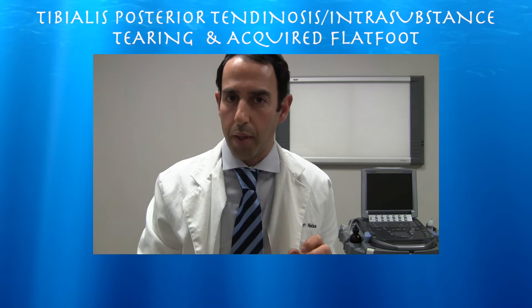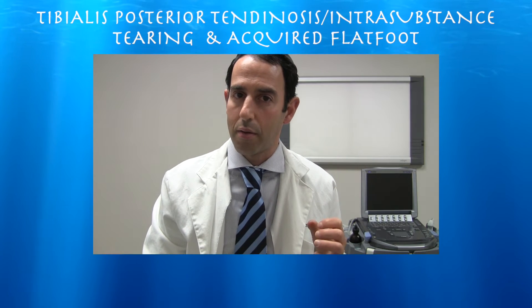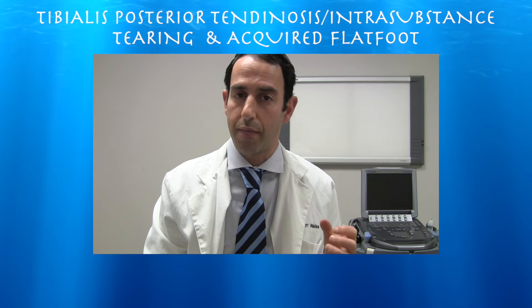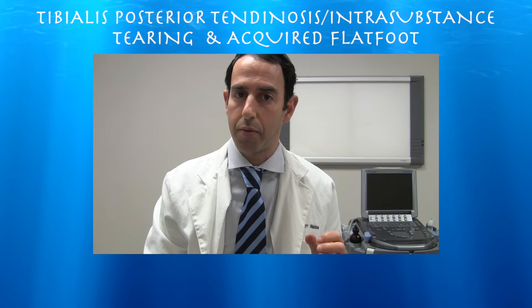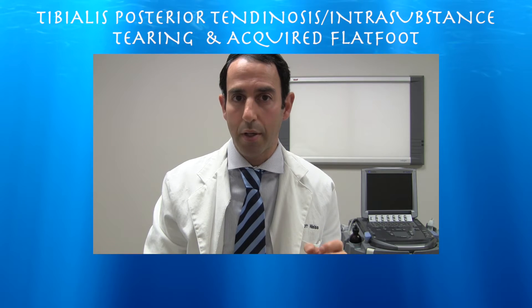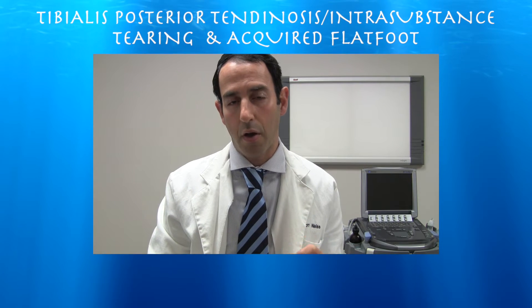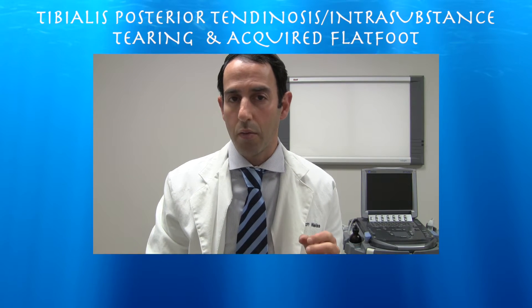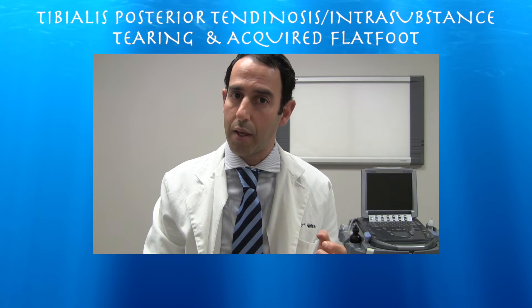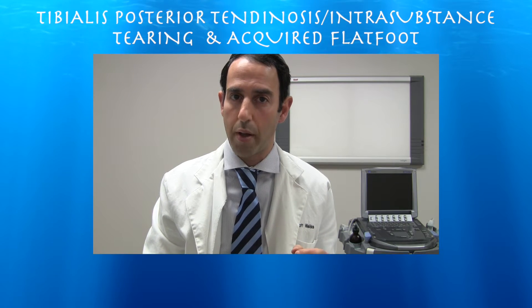This is a 48-year-old male with a flat foot deformity of the left foot caused by dysfunction of the tibialis posterior tendon. He did present with an MRI, and I subsequently did an ultrasound to compare my findings on ultrasound with his MRI, which does demonstrate a very enlarged, thickened tibialis posterior tendon with a tear within the tendon as well.